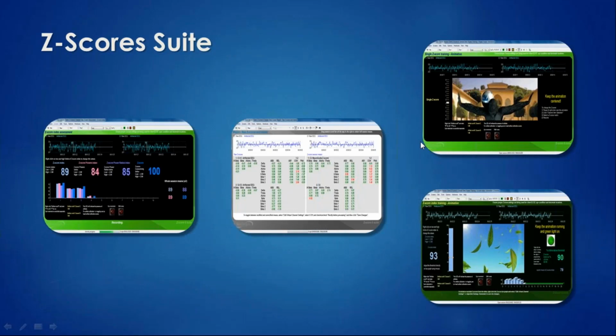To bring this back to be more specific to what Thought Technology has created in terms of application, the Z-score suite allows you to compare the individual's brainwaves that might be in front of you to this NeuroGuide database, and for you to know immediately whether their brainwave patterns are considered to be normal or whether they're an outlier and you want to train them back towards this norm.